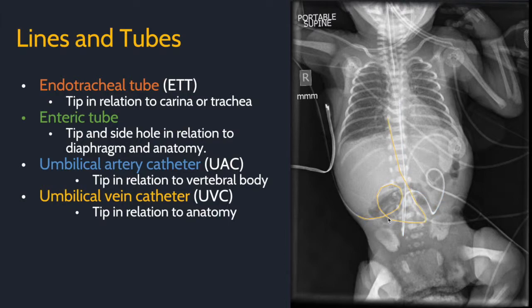The umbilical vein catheter, shown in yellow, does not dive down. It goes straight up into the ductus venosus, through the liver, into the inferior vena cava, and into the right atrium. Describe the tip in relation to the adjacent anatomy. Here, the tip is in the right atrium.